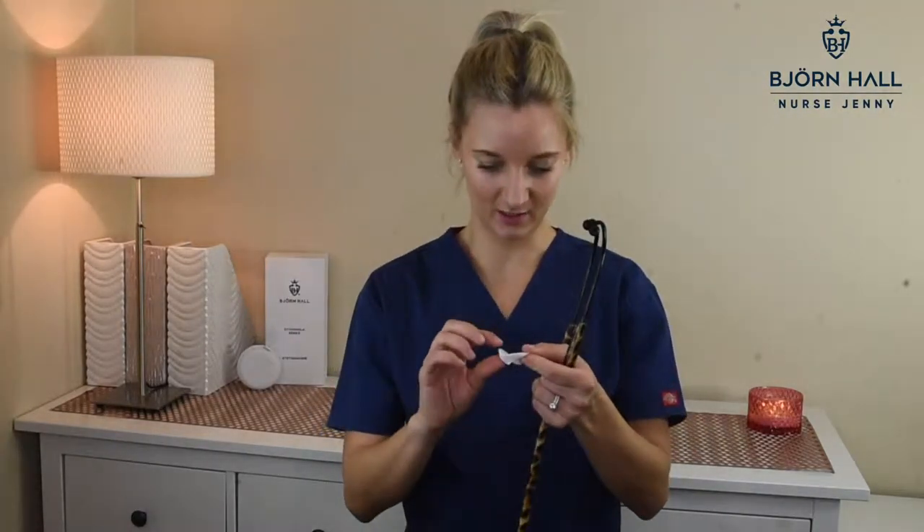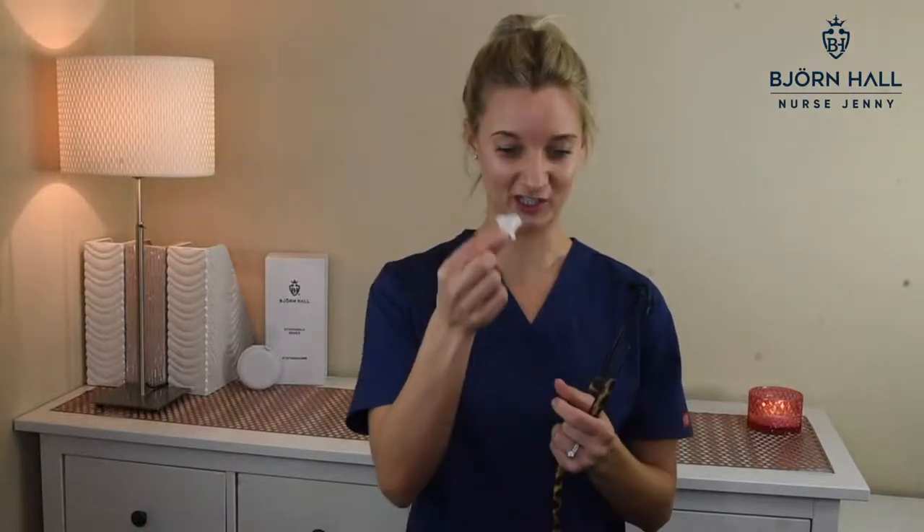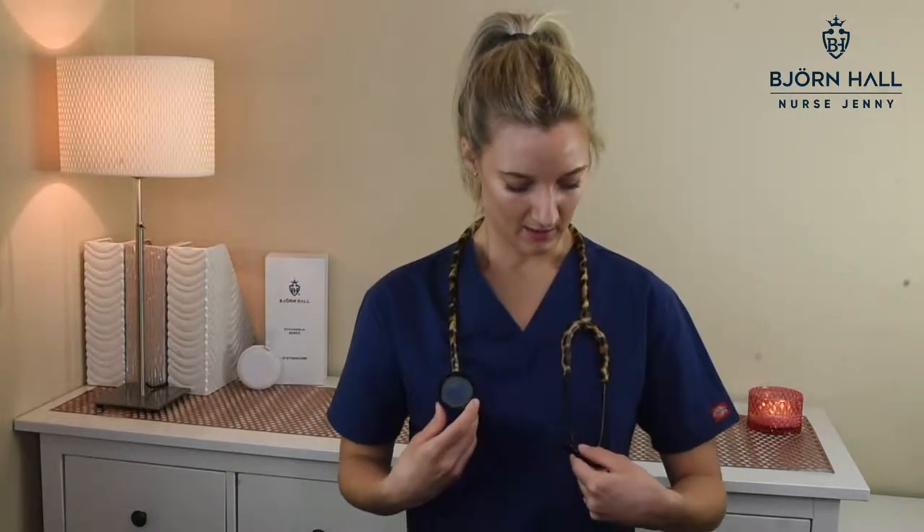I might not clean the tubing every time, but certainly the ear tips and the diaphragm. You'll be amazed at how dirty your stethoscope is — I haven't even used this a lot and it's quite dirty. So that's just a general clean I do day to day after I've used it on a patient. It's pretty easy and pretty quick. And if I borrow someone else's stethoscope — which you shouldn't, but I do sometimes — I always take an alcohol wipe out, clean the ear tips, and off I go.